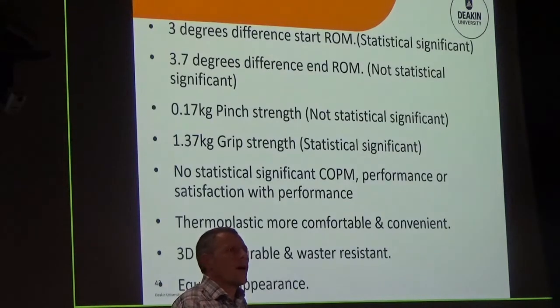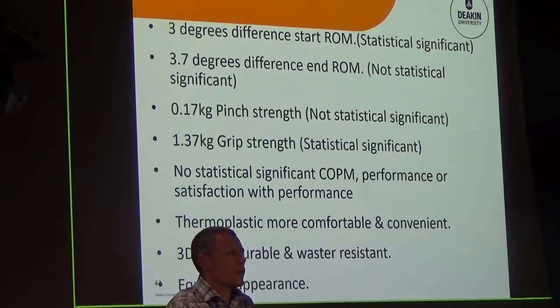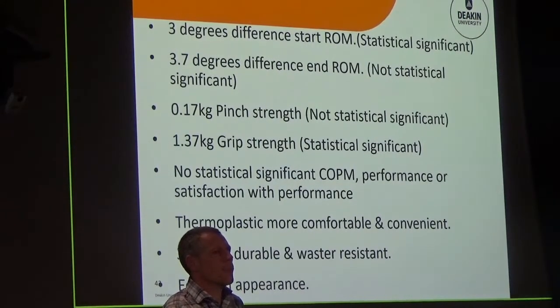So that all said and done, results were basically, as a clinical factor, there's 3 degrees difference at the start range of motion between the two, one at about 12 and one at about 15 degrees. At the end point for range of motion, there's about 4 degrees difference between the two, so not too much. Pinch strength, there's 0.17 of a kilo and 1 kilo for grip strength. So pretty similar for everything along the way. The COPM showed no real difference between performance and satisfaction with occupations, and comfort and convenience was slightly higher for thermoplastic, more durable and water resistant for 3D, equal on appearance.